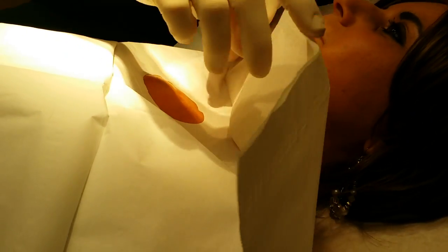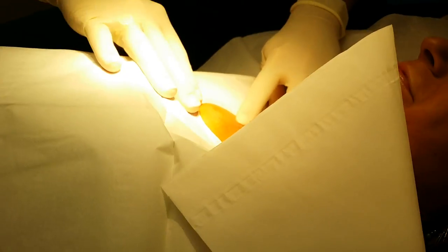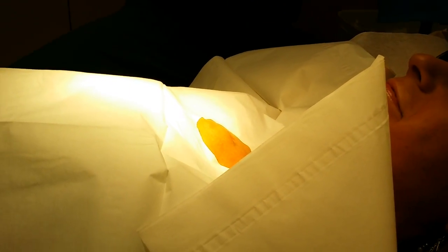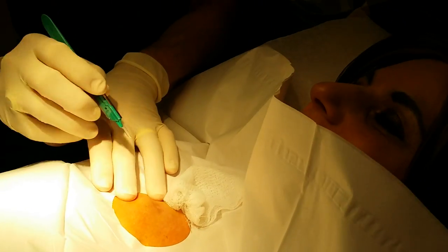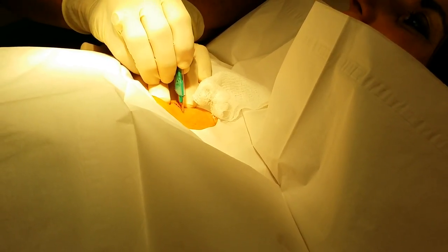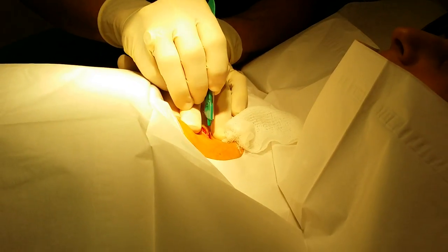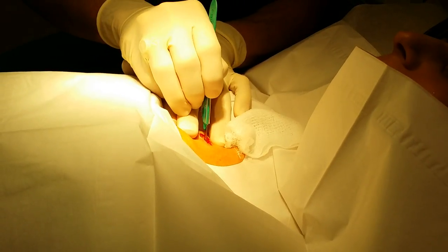You'll have to watch the video. Here's the scar from the previous operation — I can feel your port right under there, and we're ready to go. Are you ready? I'm ready.